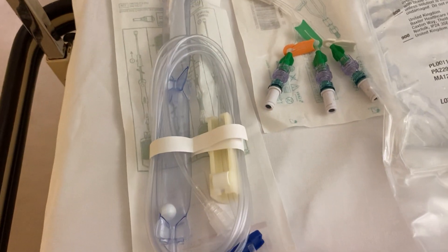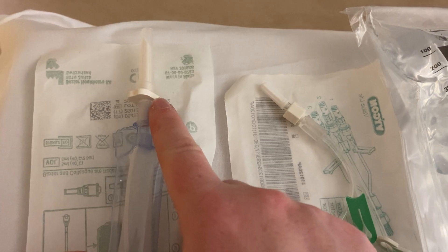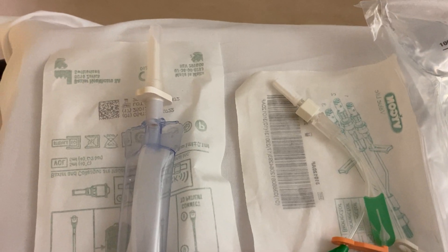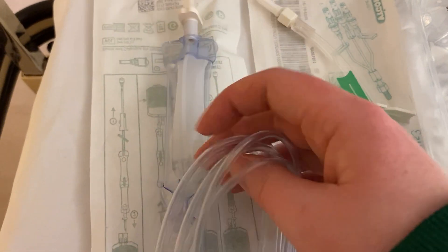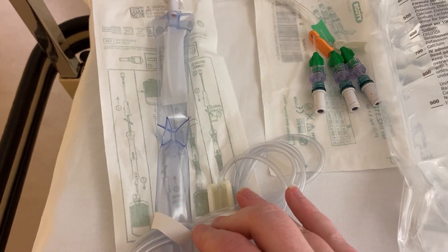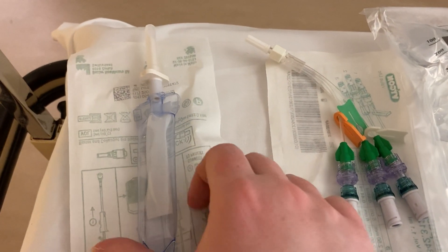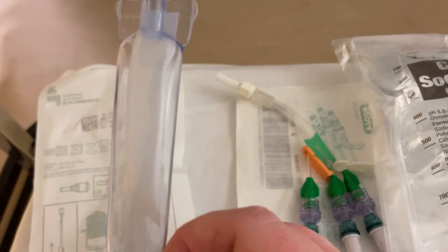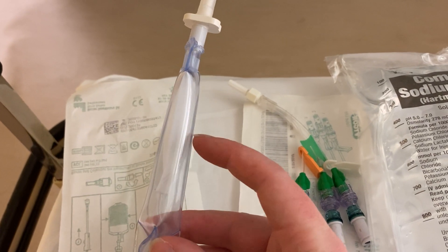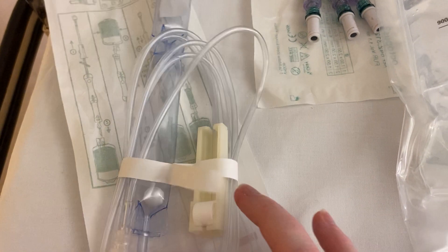Then we have blood giving sets. The difference is that you spike the bag and blood flows into two chambers. The purpose of the two chambers is to take out any debris and any air. The first chamber has a little filter built into it — that catches any debris, and bubbles tend to gather here and burst around the outside of the material, so down into the second chamber there are far fewer bubbles.